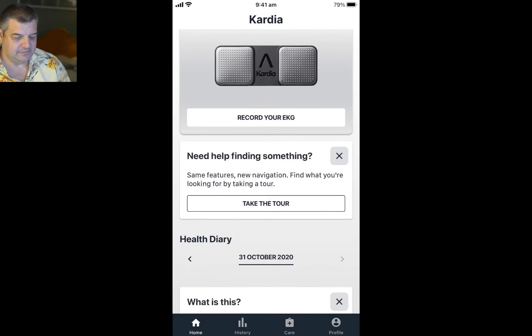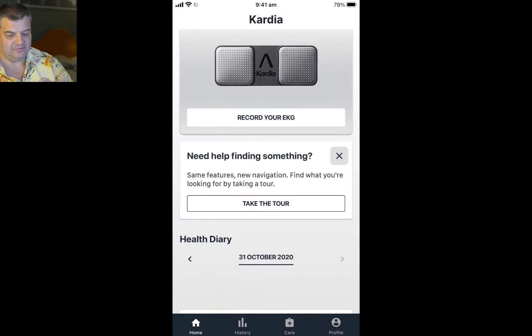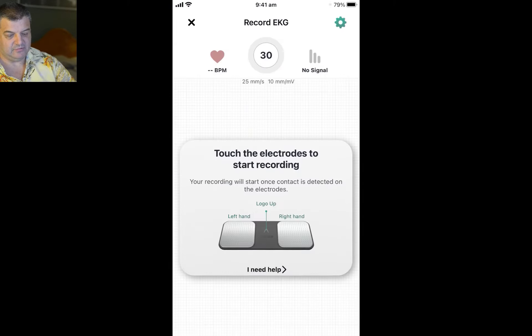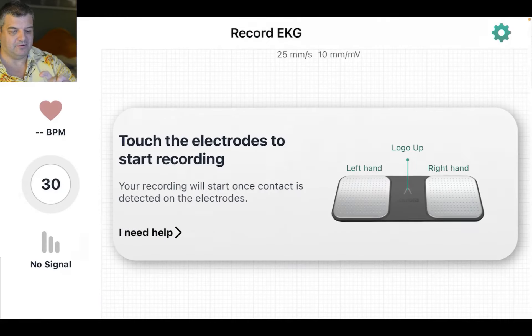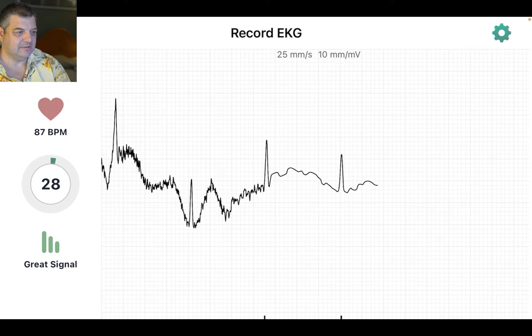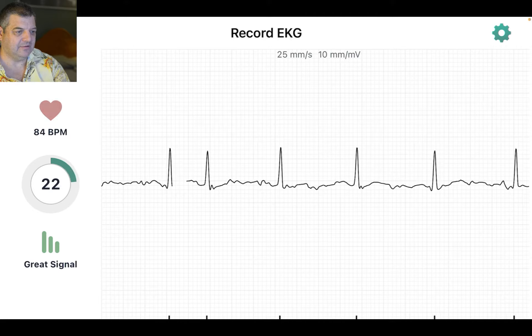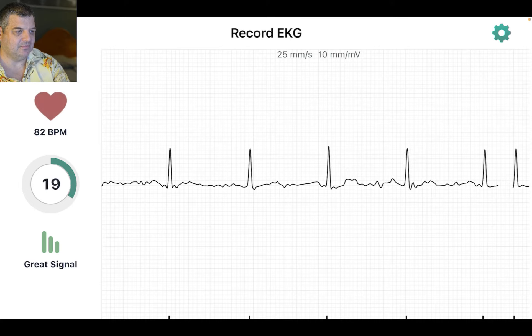Let's have a look, I'll do it live. Let's get the screen up. I want it to flip over — there we go. So you touch the electrodes to start recording, and I'll do that now. It's initializing. It takes a few seconds to stabilize, and it takes 30 seconds to record the full ECG.